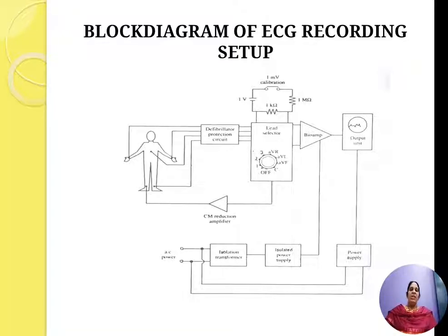Then we have the lead selector switch, the calibrator, the bioamplifier, the auxiliary amplifier, the isolated power supply, the output unit and the power unit.